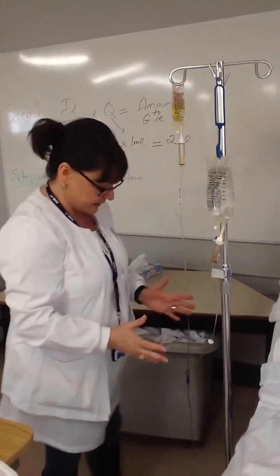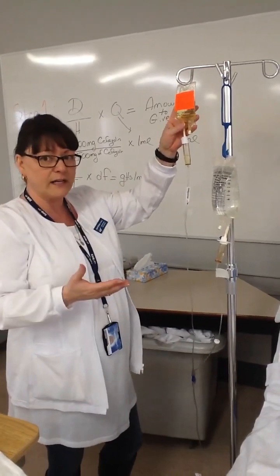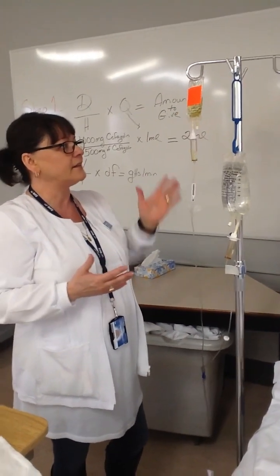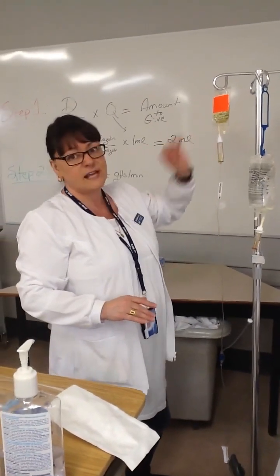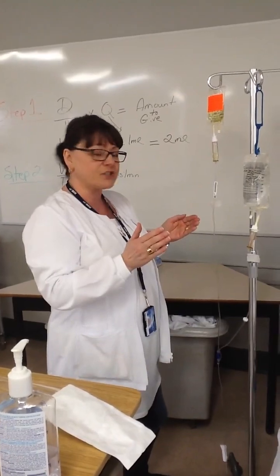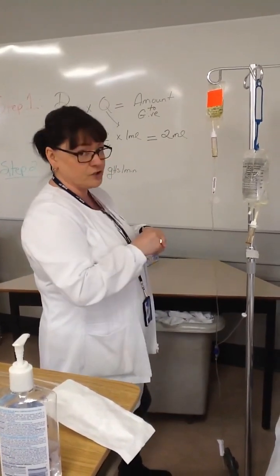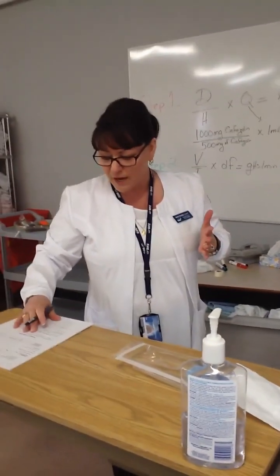So now we have everything connected. We know we have a safe dose. It's so rewarding as a nurse to know after you've done your math and you've prepared and you've done all of your checks and you've applied your rights that you have a safe medication there hanging and you're ready now to just finish your calculation and move on to counting your drops. So we're at the very last stages of our work.